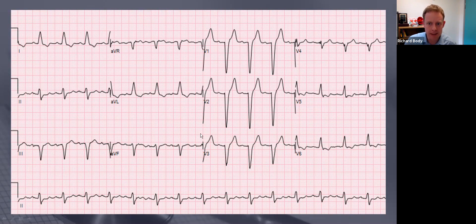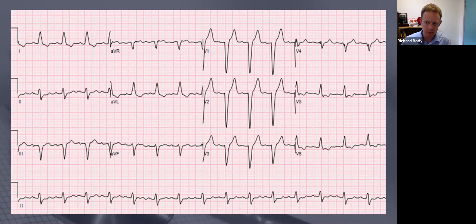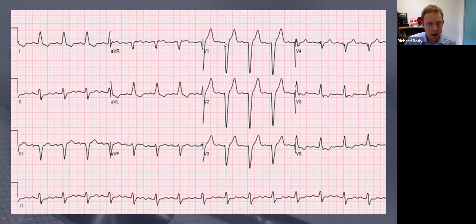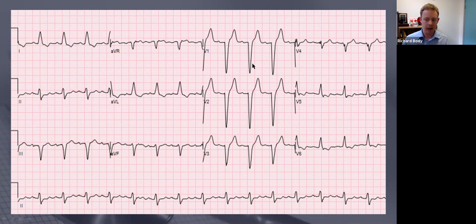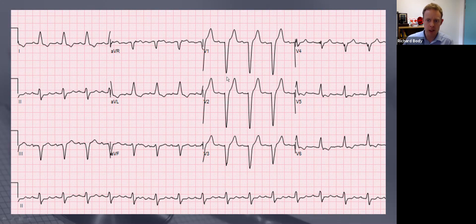What you'll notice is we've got broad QRS complexes. So we're thinking: why have we got broad QRS complexes? Is it a bundle branch block? Well, it might be. Let's have a look at lead V1 - this is going predominantly down, and in lead V6 it's going predominantly up, so that's left bundle branch block. In right bundle branch block you'd get at least some R wave in V1, and you don't have that - it always goes downwards. It's left bundle branch block.